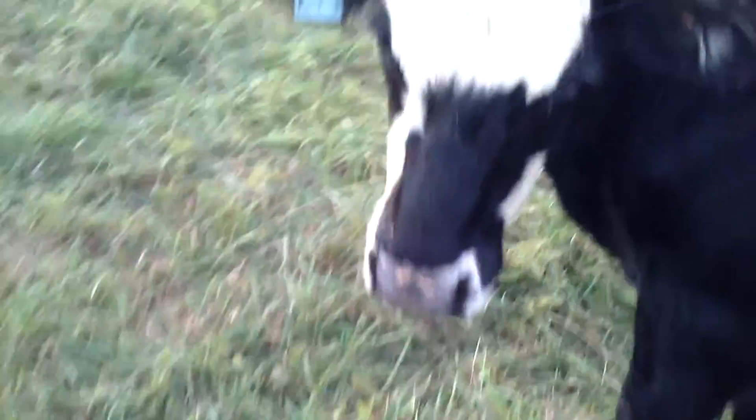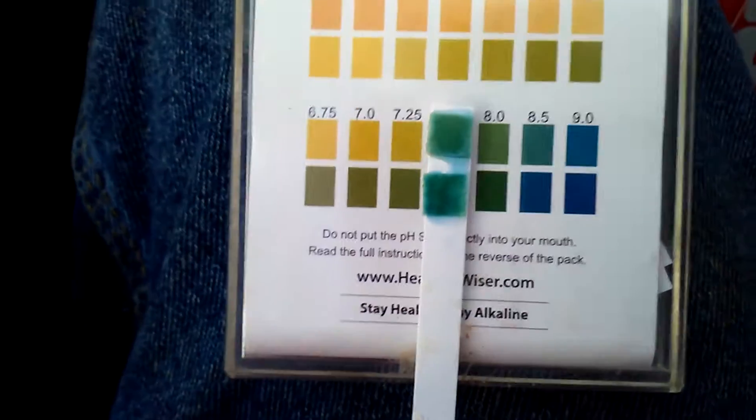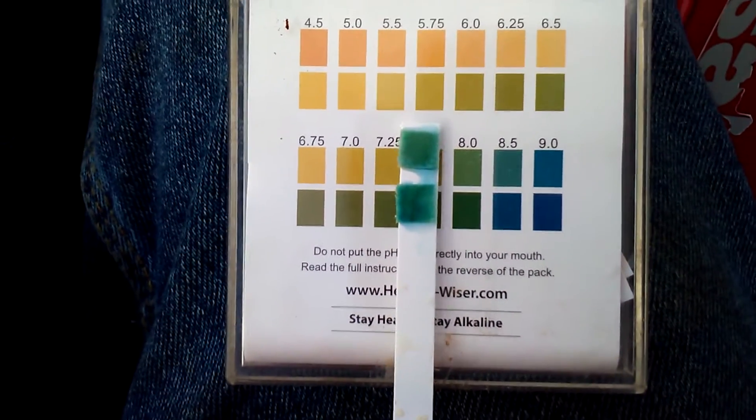And there's what we've got. Now we'll check that with the scale. We're checking your urine. If I was to compare it to any, I would compare it to an 8. So the pH is a little high. We should be right at 7.